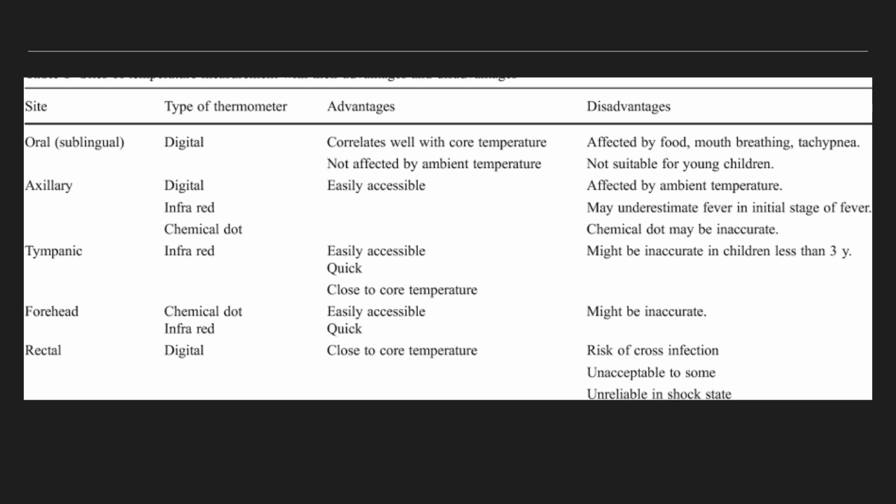Poor measurement technique is often responsible for errors in measurement, usually false low readings. To obtain an accurate reading, hold the pinna and gently pull the ear slightly upward and backward to straighten the ear canal. Pull pinna down and straight back for a child under 3 years old. Fit the probe snugly in the client's ear canal, and angle it toward the jawline.